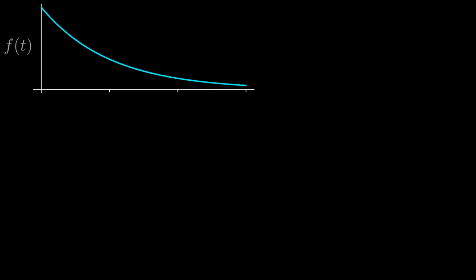Let's start with the decaying exponential, which is how we model the free induction decay, or FID, in NMR. We'll write the decay function generally as e to the minus alpha times t, where alpha is a positive real number. We'll consider this function on the interval 0 to infinity, thus defining the beginning of the resonance phenomenon at t equals 0. I encourage you to pause the video and see if you can work the Fourier transform of this function on your own first.